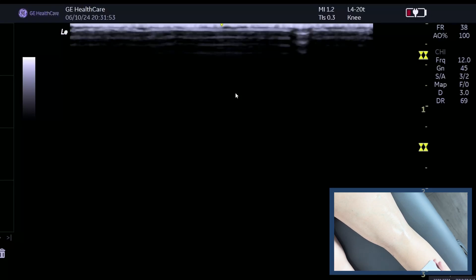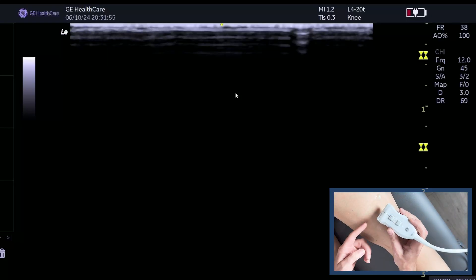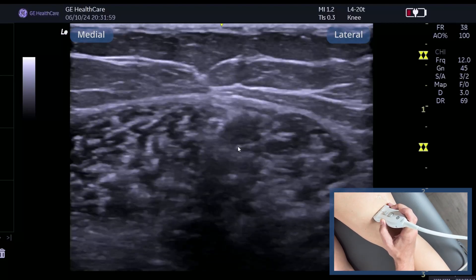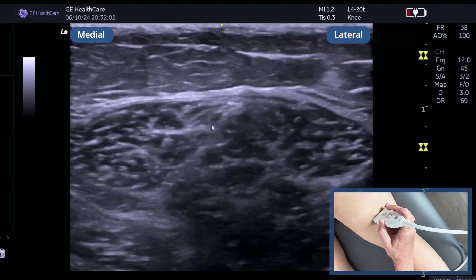Now we're going to have a look at the common peroneal nerve. The first thing I'm going to do is just check left is left, and I'm just going to place the probe onto the lateral aspects of the distal leg.